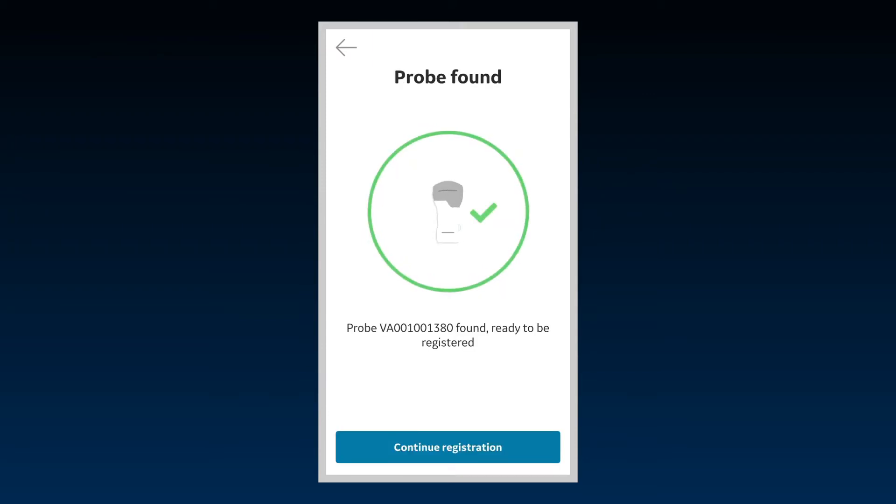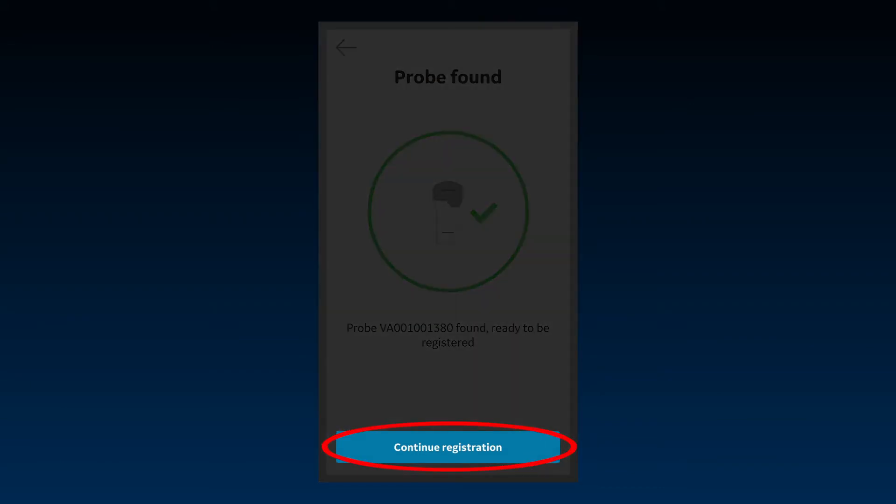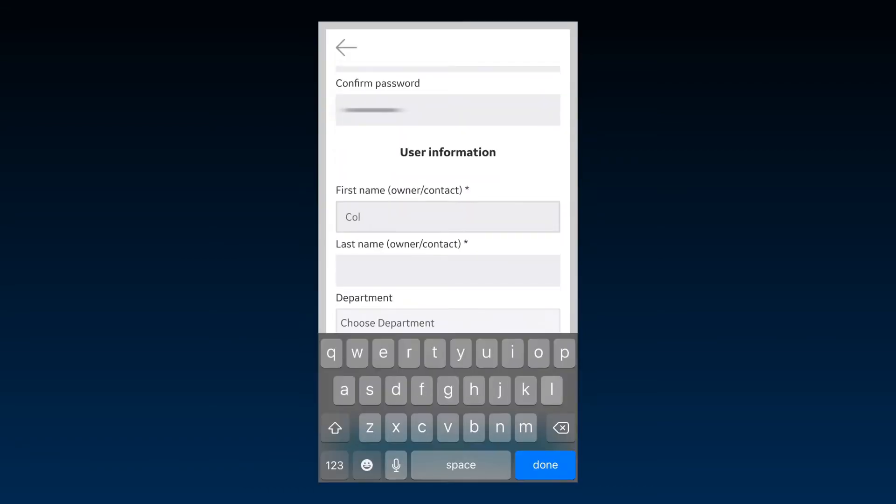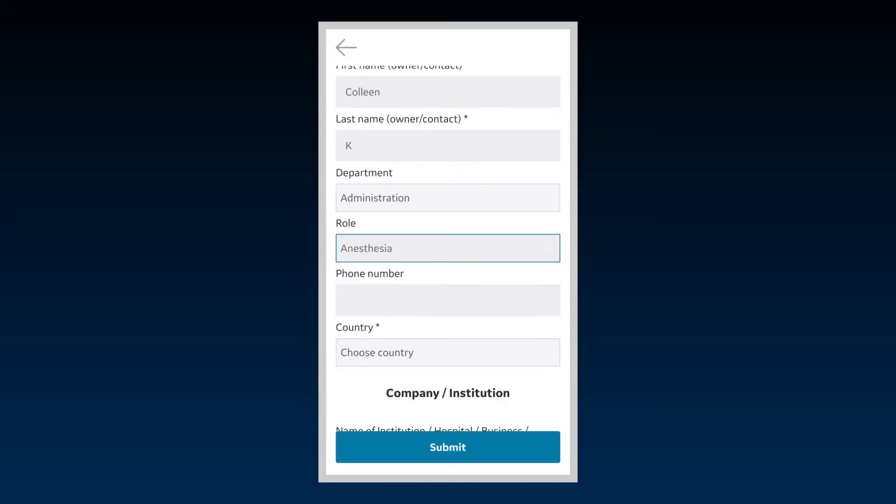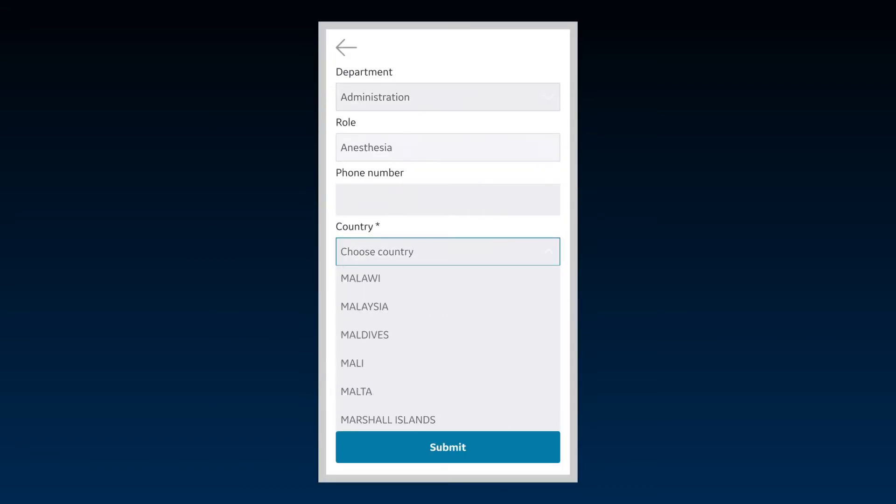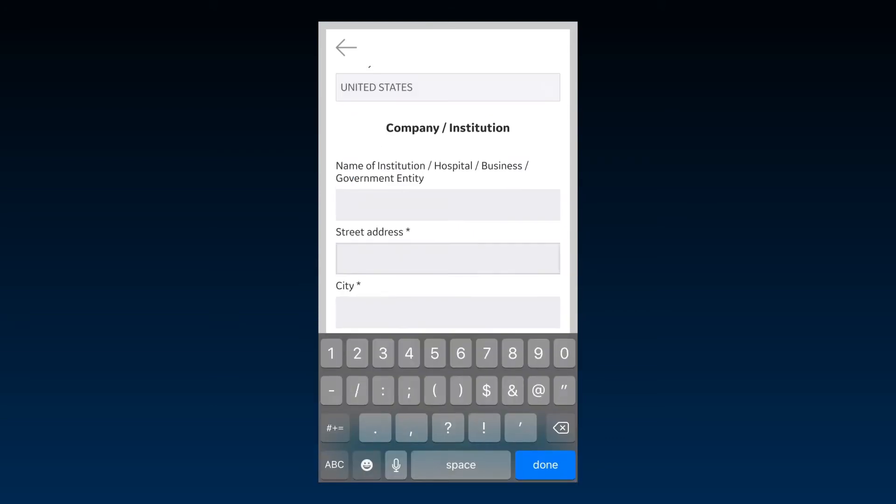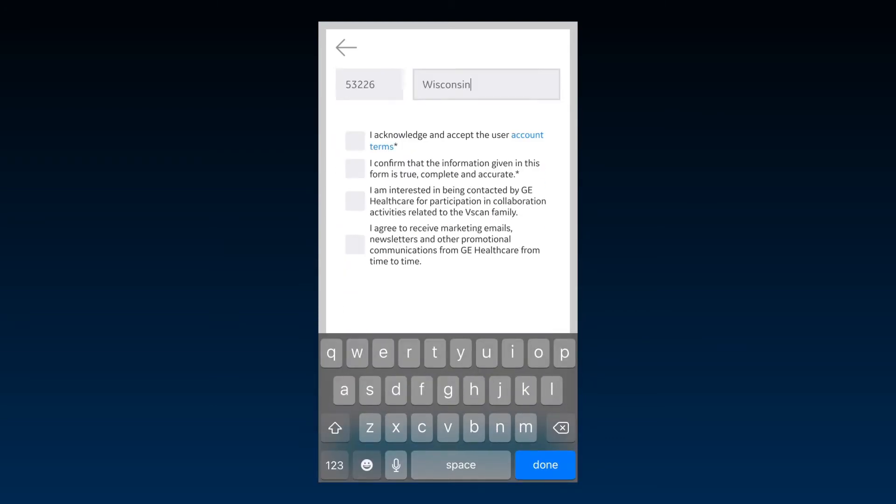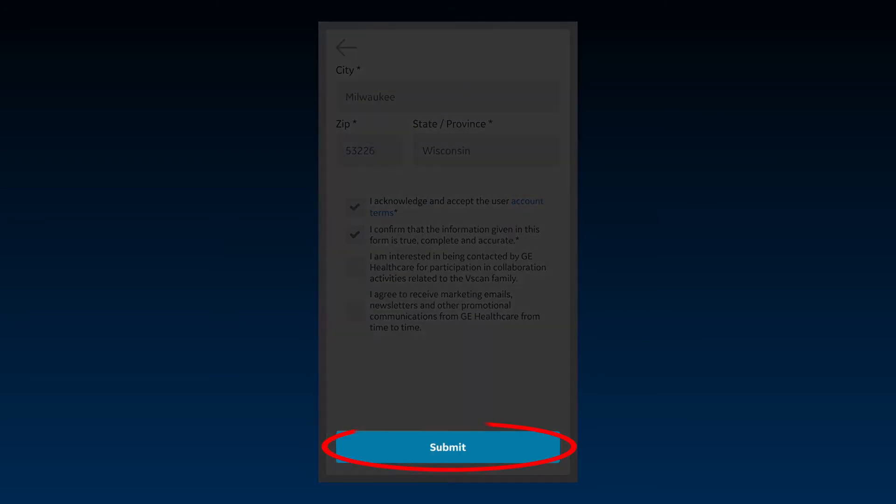Once the probe is connected, it will display a confirmation message. Press Continue Registration to proceed to the account creation page. Enter the required information and accept the account creation terms at the bottom of the screen. Then press Submit.